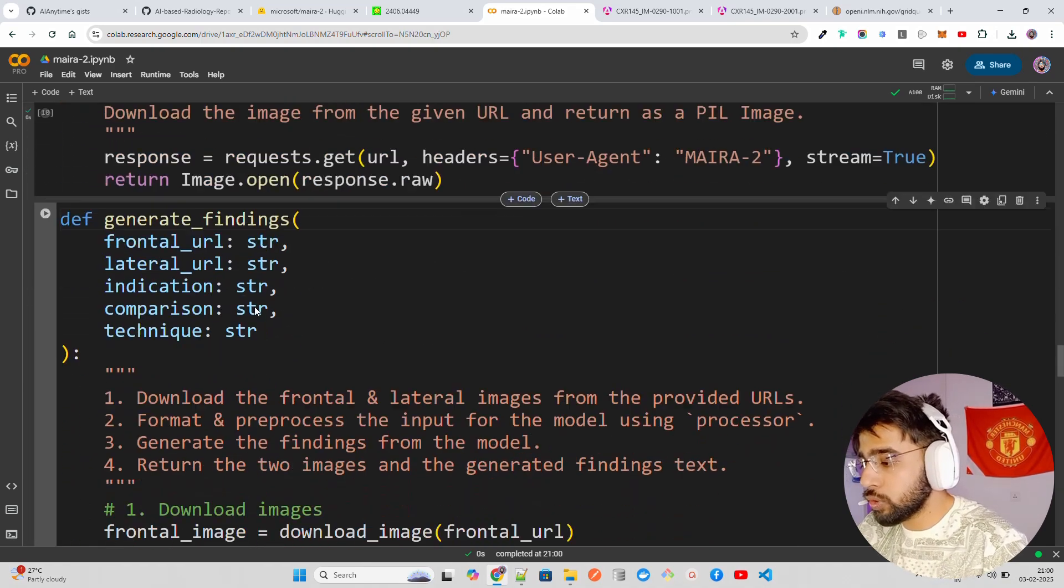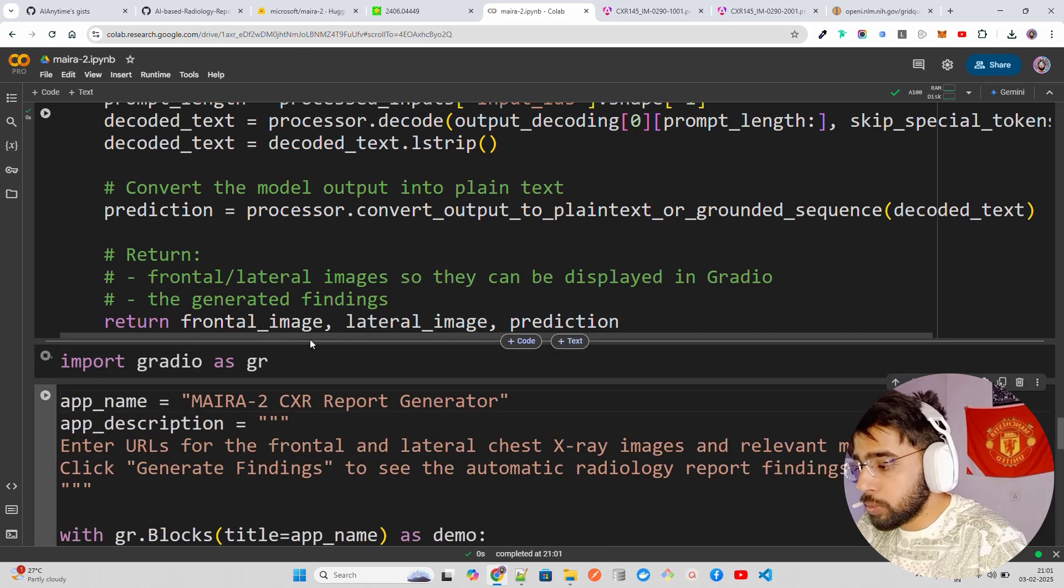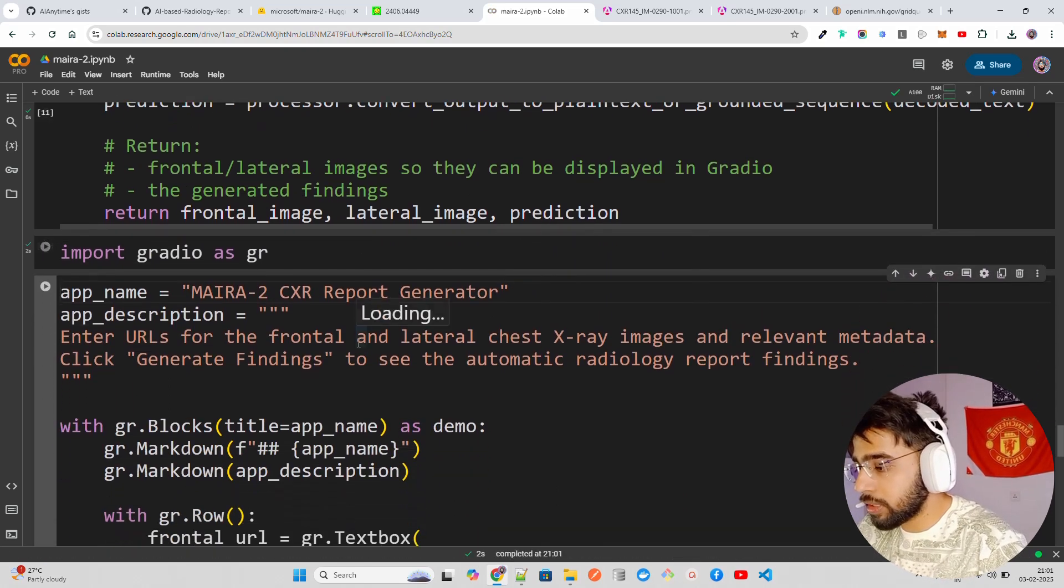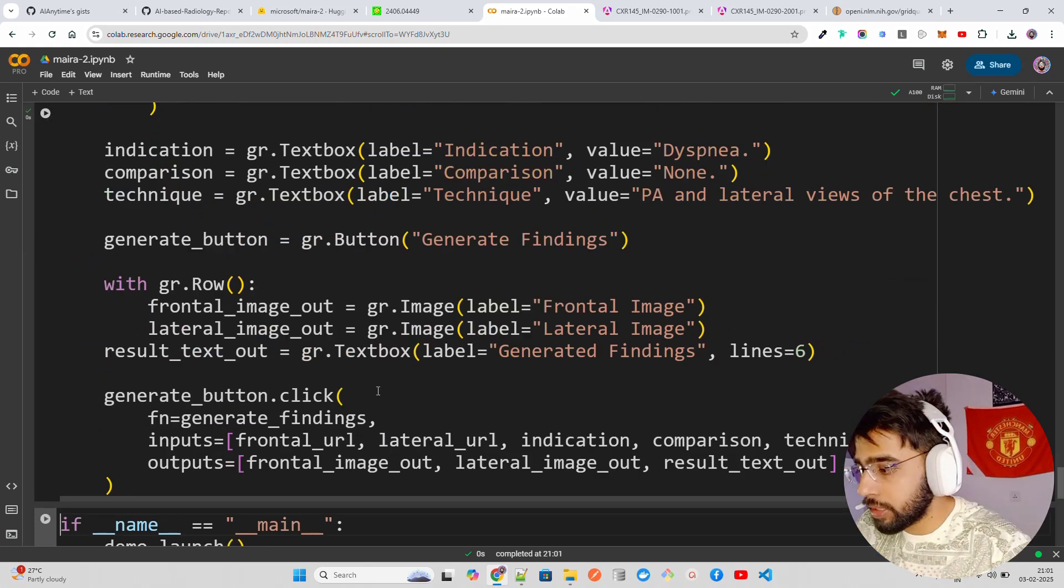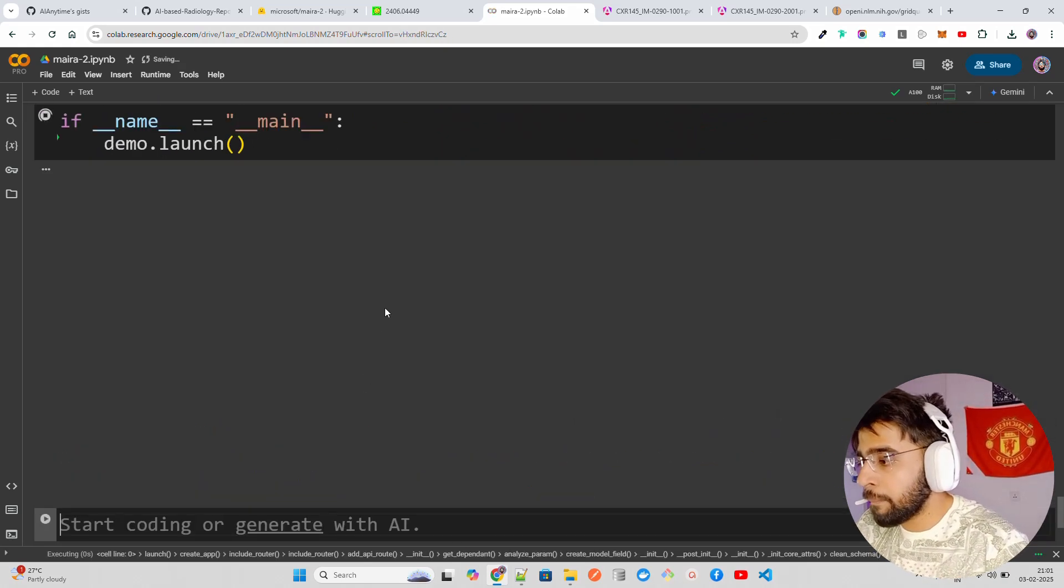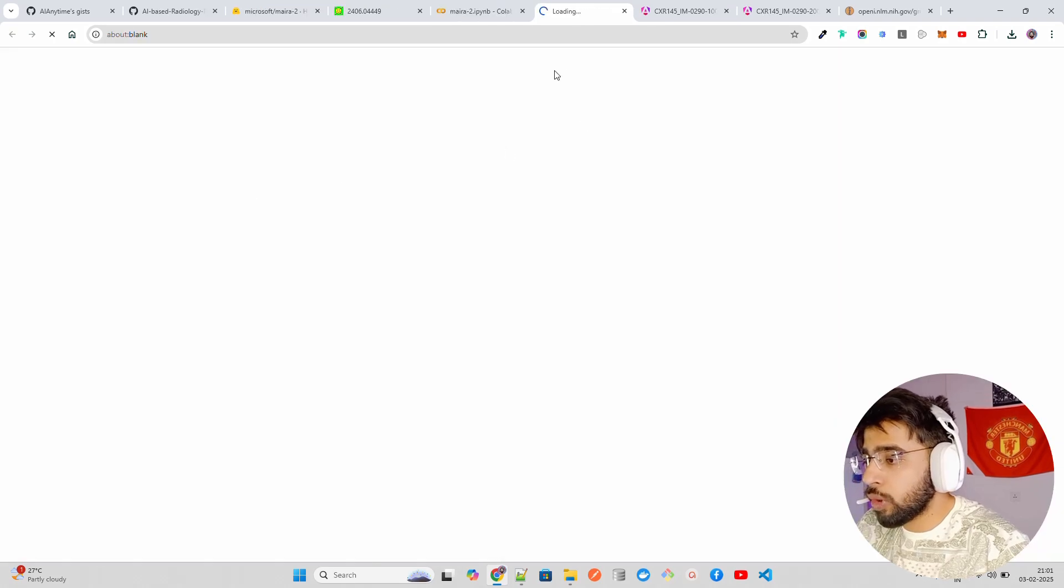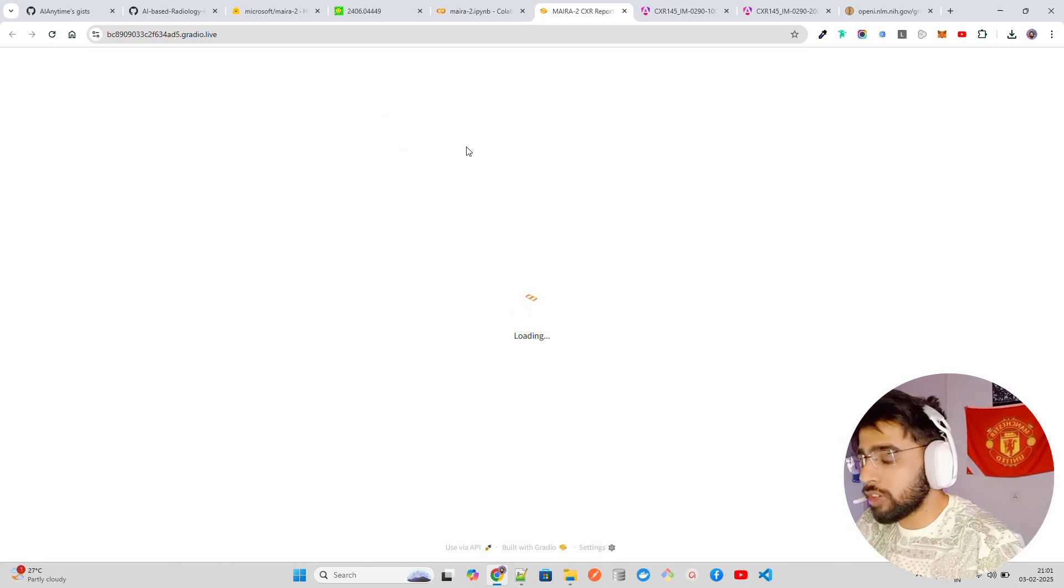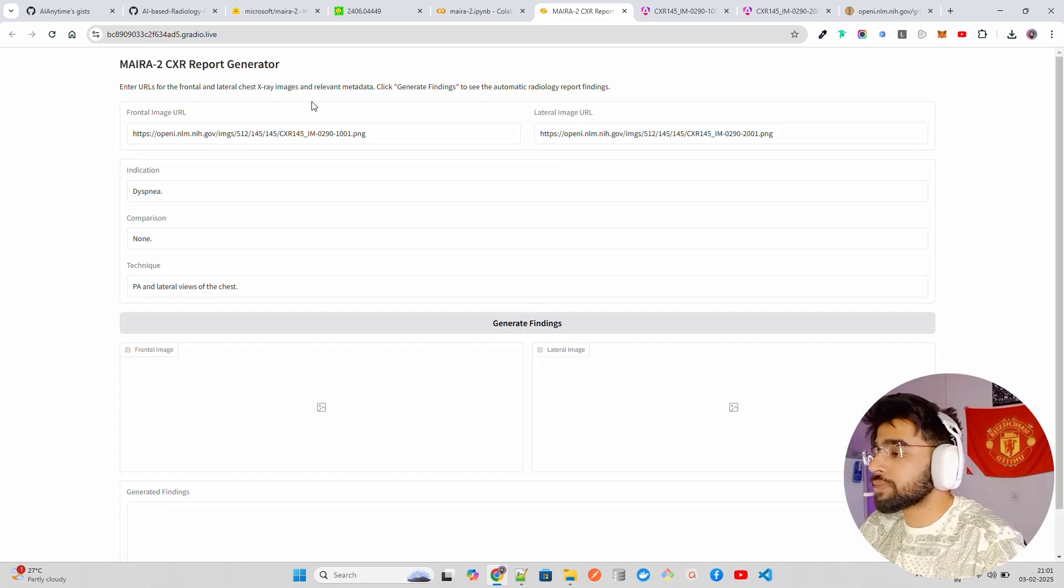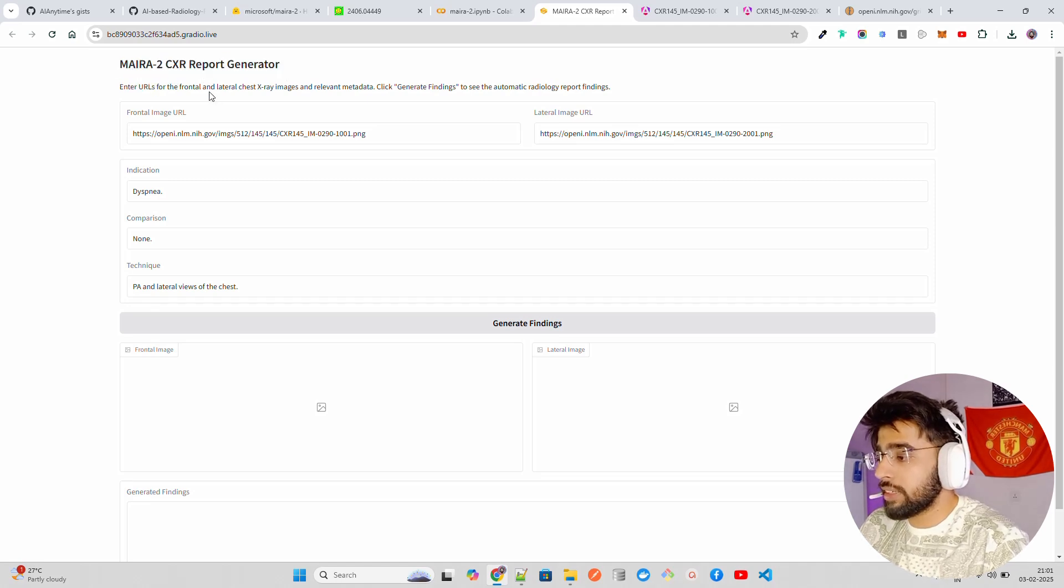I'm probably not going to cover this in too much detail because this is pretty easy. You can do with any transformers model. You first create the input IDs, token IDs, get these input IDs, get the logits, then get the results, and then decode the IDs to get the results. That's what we are doing over here. Let me just import the Gradio app. I'll give this code guys, you don't have to worry about it. This entire notebook will be available.